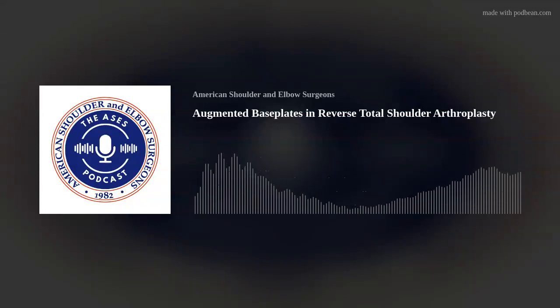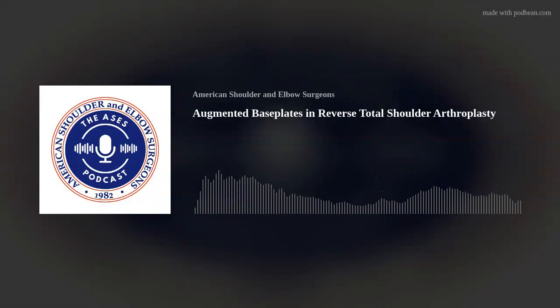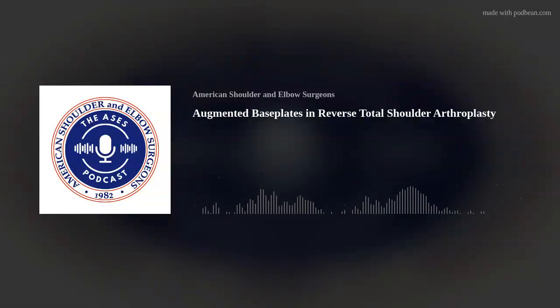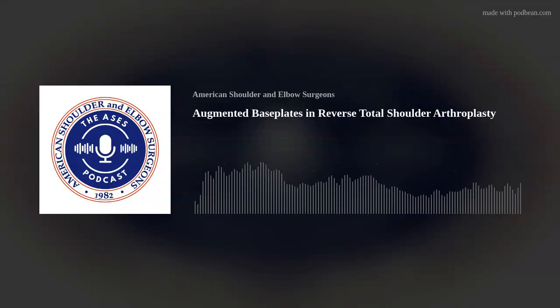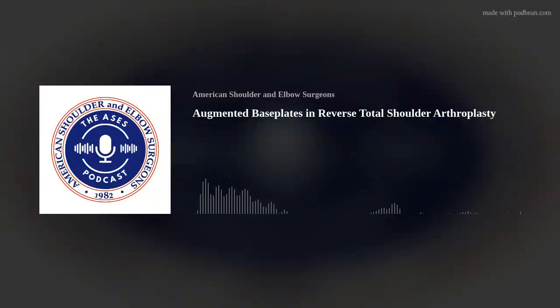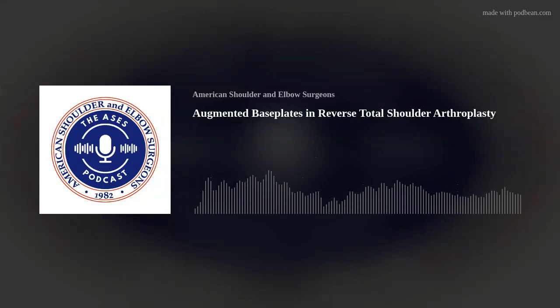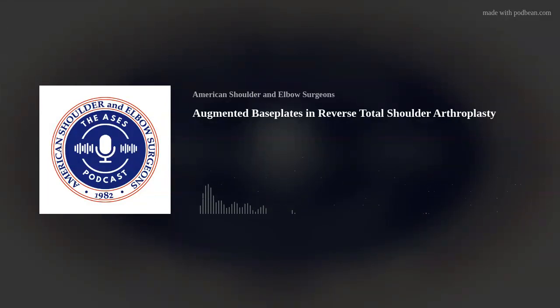For the uncontained defects, which are really hard, and there's uncontained and there's really uncontained. Sometimes there's a little bit of a rim there. I often talk to the patients about various scenarios where, in an ideal world, I would love to do it all in one stage with femoral head allograft or alternate center line. I'll sort of base that off my planning. If I think I can do alternate center line, I'll do that, plus or minus graft.